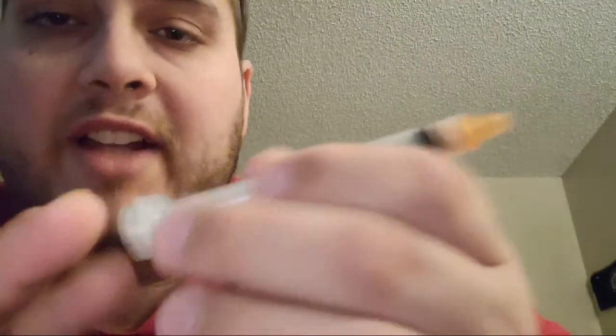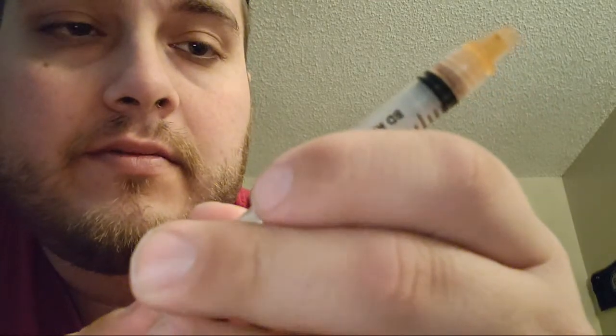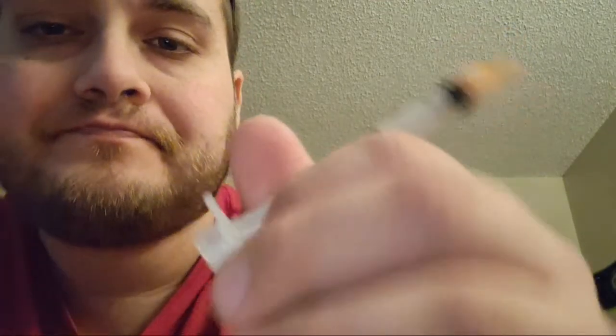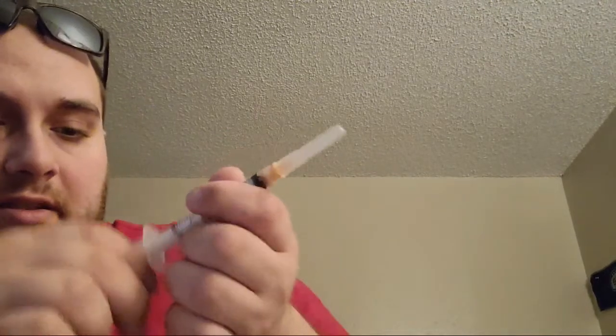So to make it retract, you have to push it really hard in all the way. And that's how you do it. And it retracts the needle. That's smart. Now nobody can get hurt. There's no possible way. They can't open this thing no more now and everything. Great.